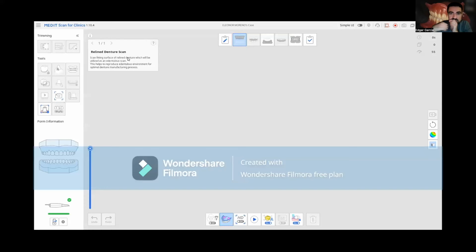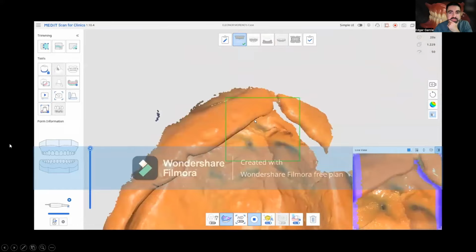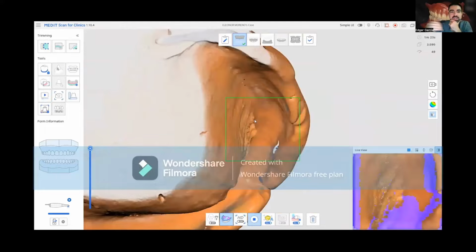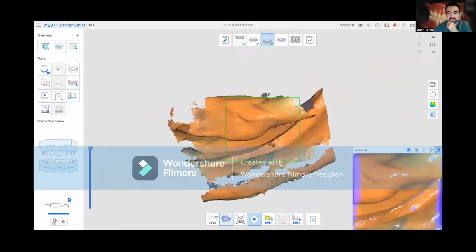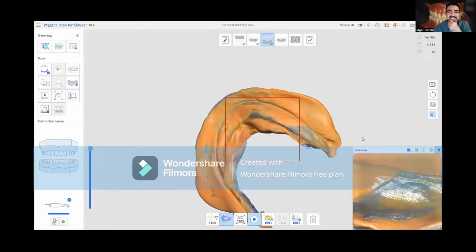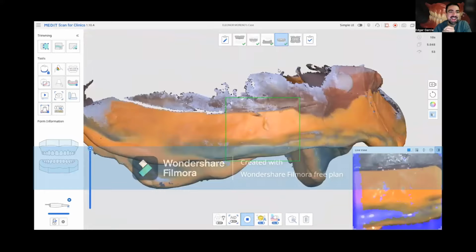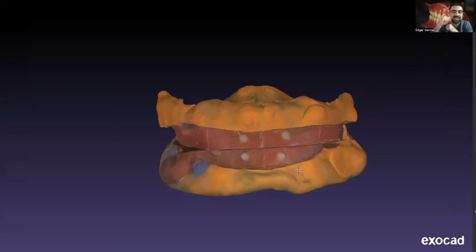In the Medit software, the first thing that I do is scan the intaglio of my impression. I go with the upper impression. After that, the software has steps that make this part easier. I go through the scan of the bite rim, the wax, and the base plate. Then I go to the lower one. You do this outside the patient's mouth, obviously. After these steps, I put them in the patient's mouth and do the occlusal scan. After this, I export the meshes to Exocad.